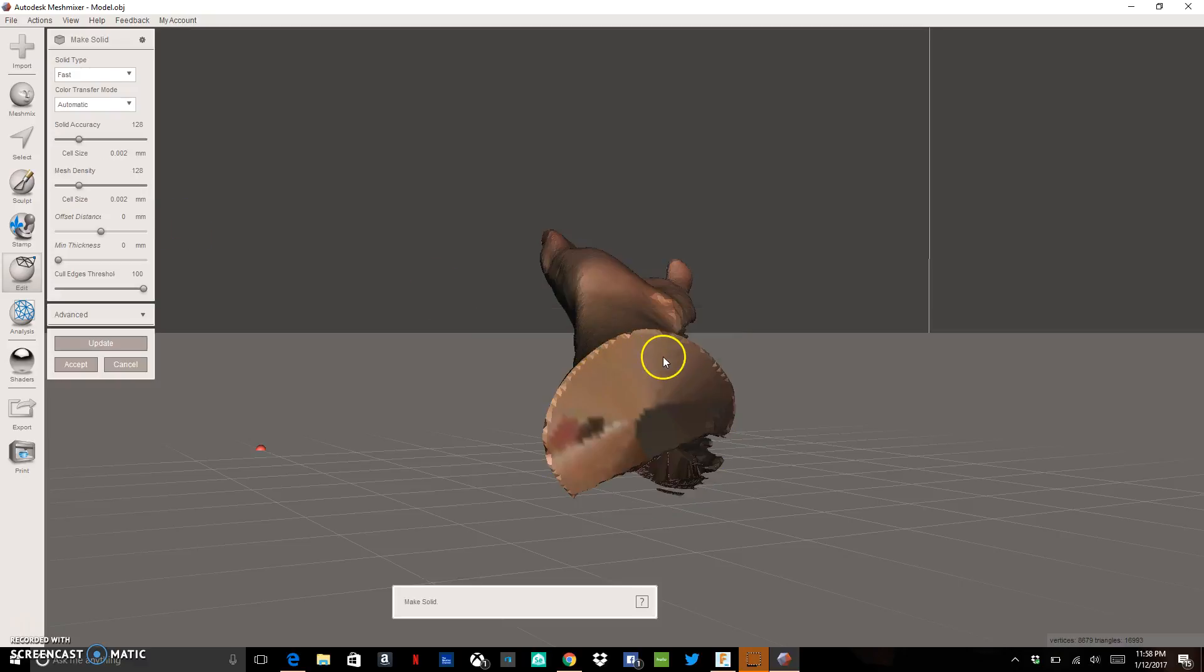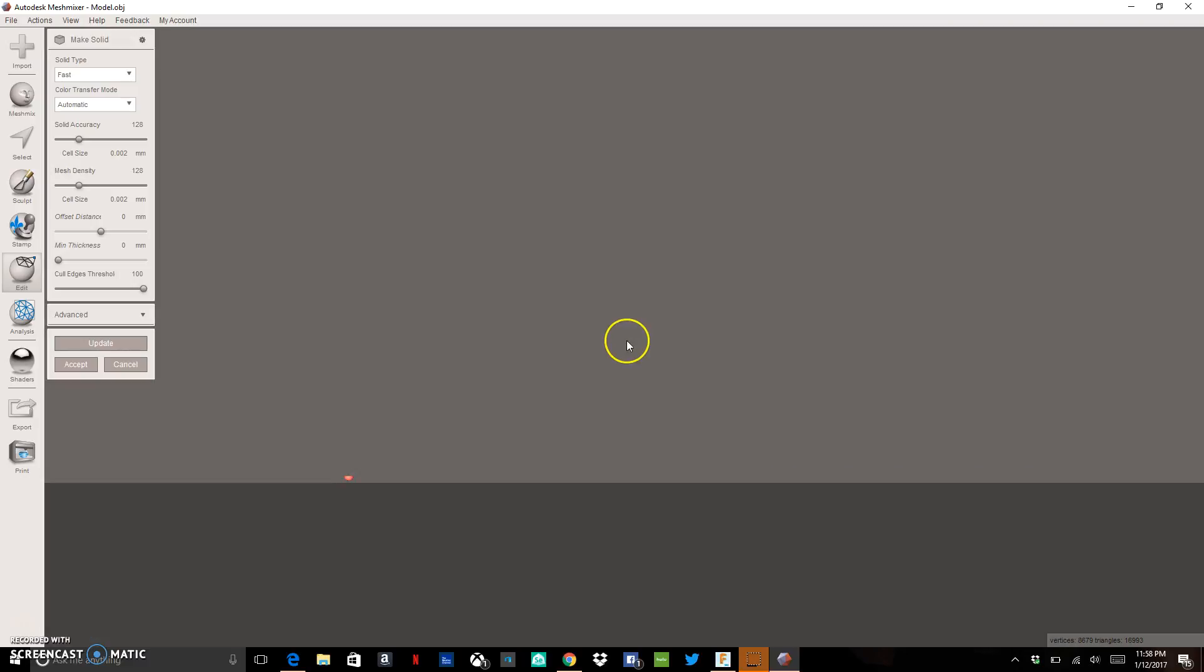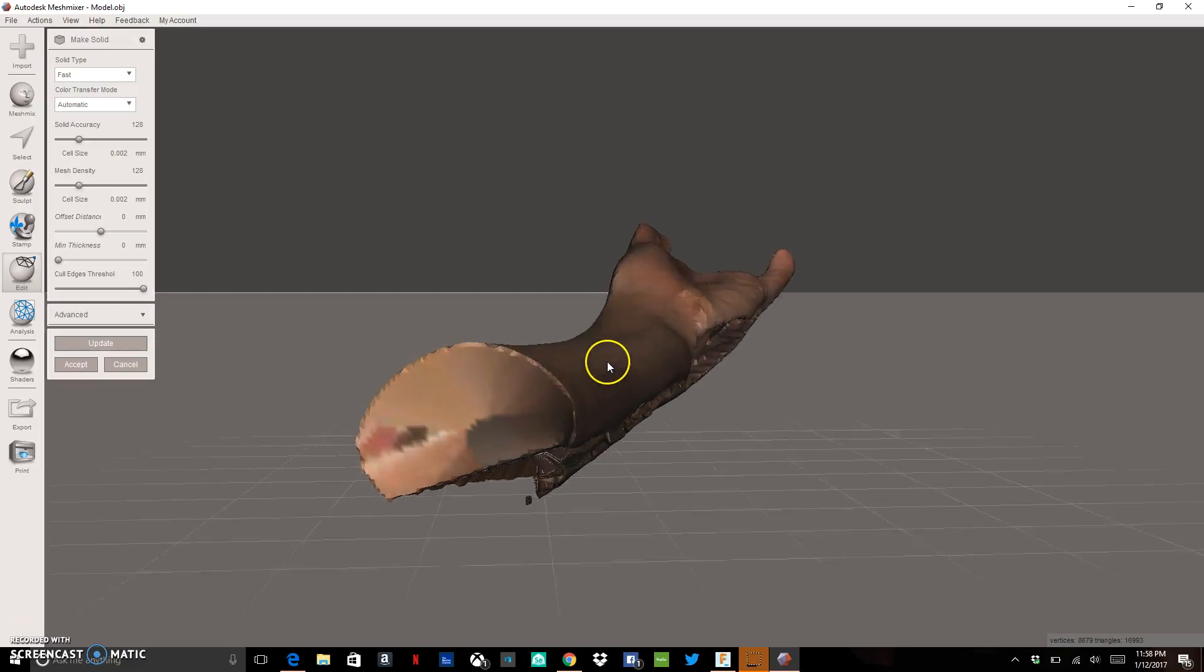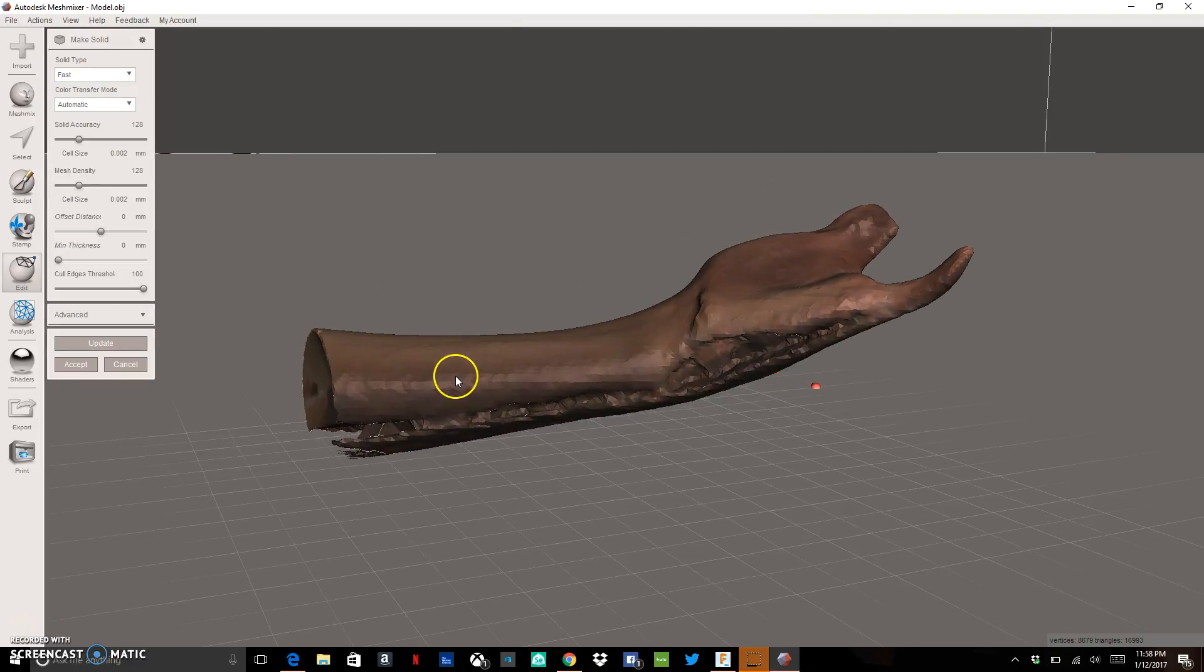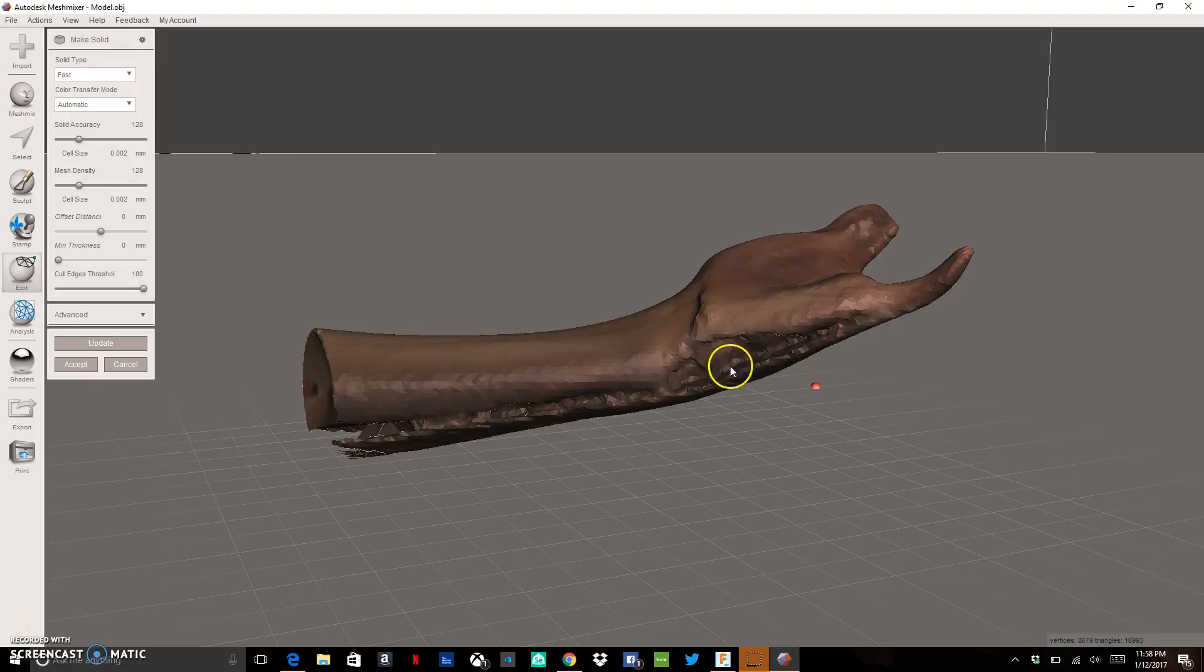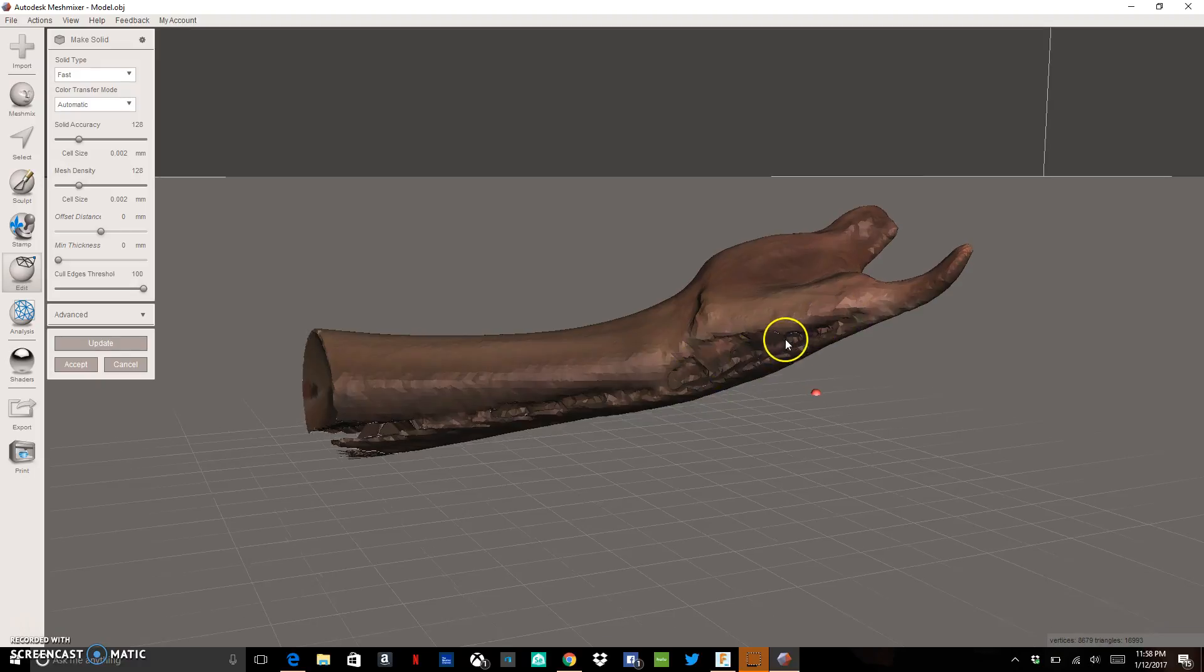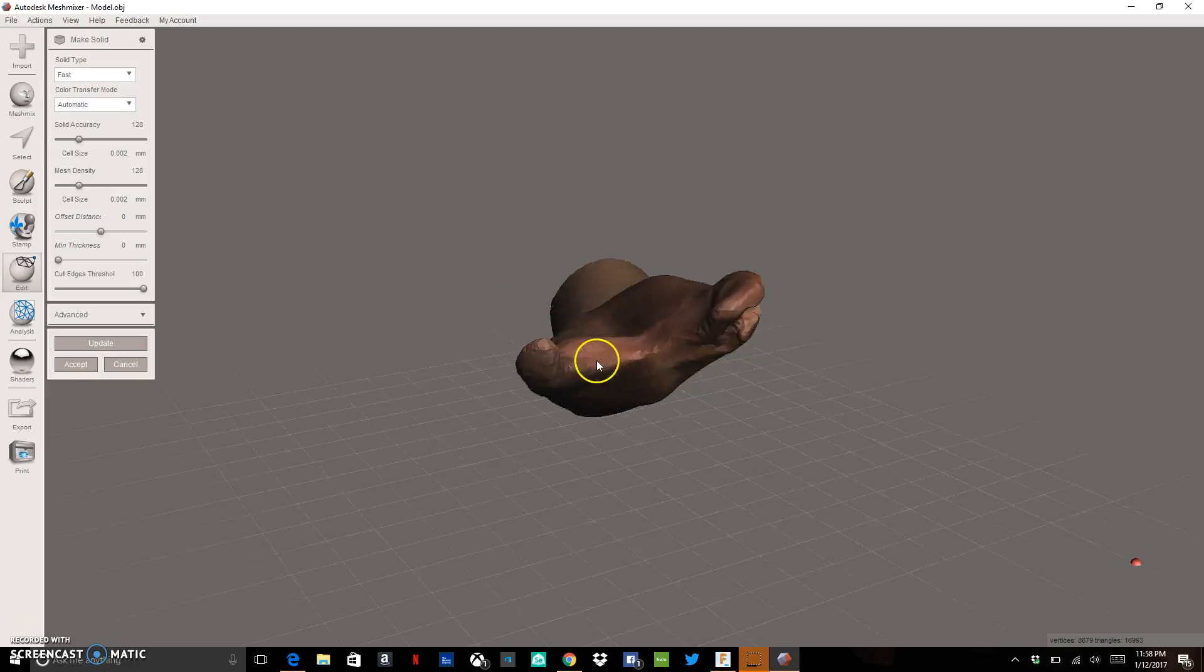So we're going to do that and we're going to get out a solid model. We can see that this particular scan has a few little holes in it still, so it's kind of rough right here. That's okay.